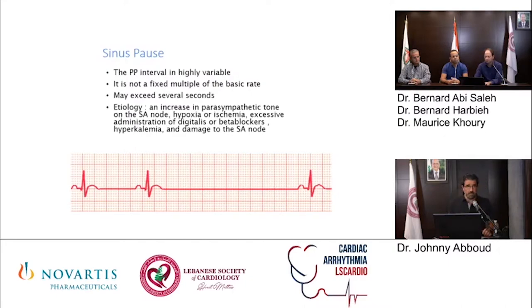Because we have other etiologies that can cause syncope at this age, like sinus pauses. In a sinus pause, you will have the absence of a P wave. It can be prolonged for a few to multiple seconds. And also it is associated at this age with sinoatrial node disease.